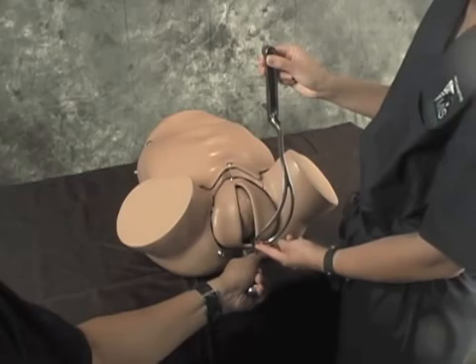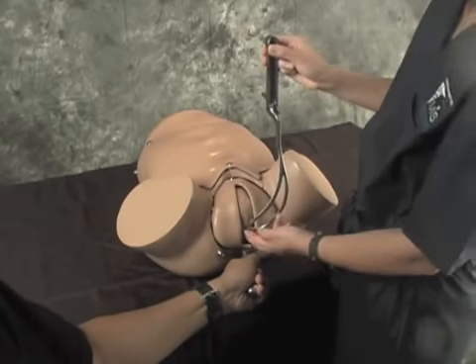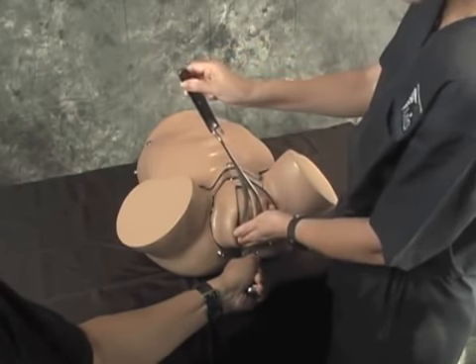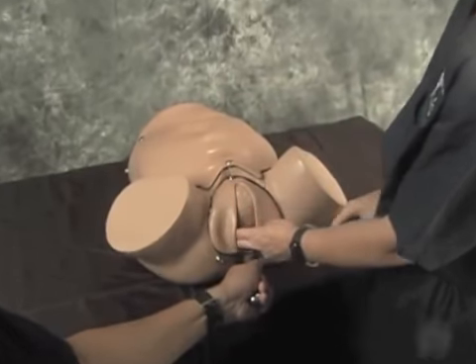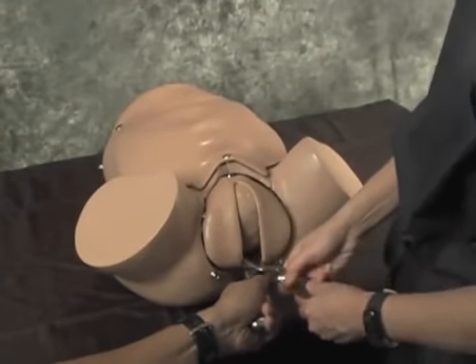Now insert the right blade in a similar fashion. Hold the right blade with your right hand. Insert your middle and index fingers of the left hand in the vagina and insert the right blade vertically, then arc the right handle towards the patient's left thigh. Then bring the handle towards midline, parallel to the ground.